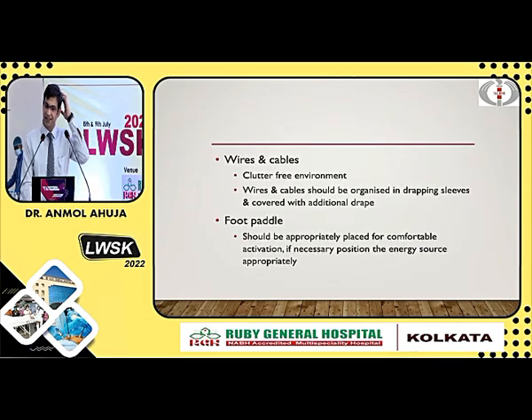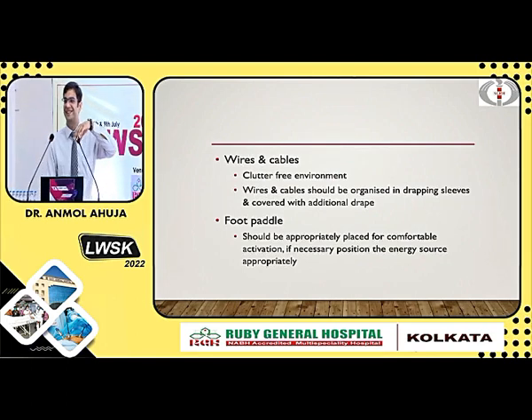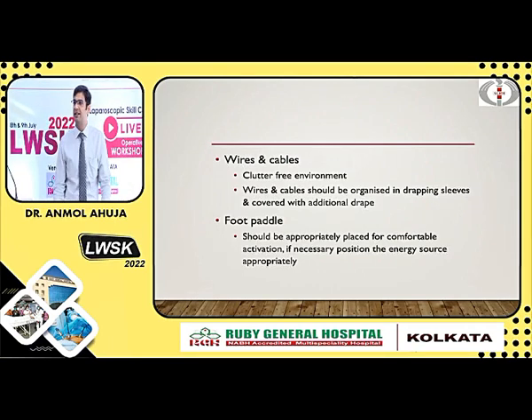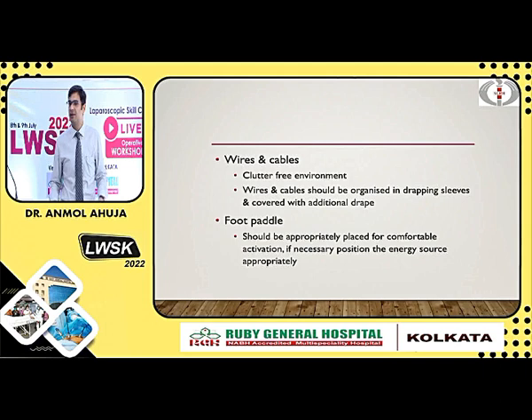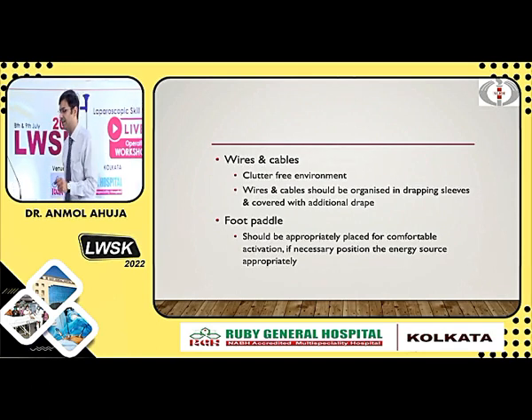One more important thing is this, I also noted very late, I think 6 months back. Ramana sir is here, so he told me this. Once we are standing in laparoscopic surgery, we usually are very fixed at our knees. If you note, after some time you will have very stiff knees while performing a longer surgery. So it is always a good idea to have a little bend in the knees, keep it loose. That is one important thing. But once you are doing the surgery, you will forget about it. Again, you will be standing very stiff, and after some time you will feel some pain in your knees. So all these things are very important.